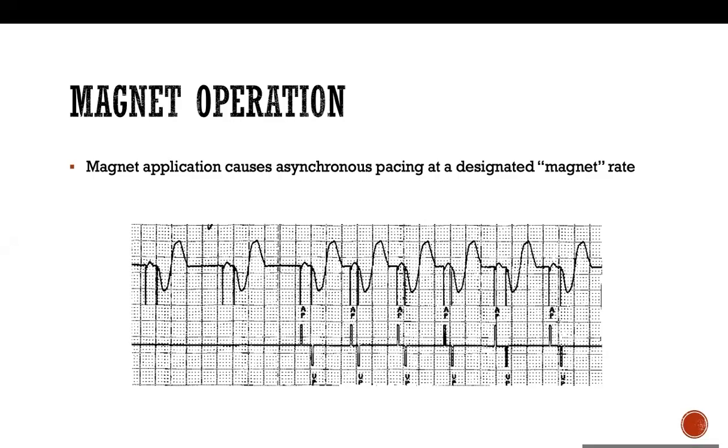So you would change the pacing mode into asynchronous mode. So what is the asynchronous mode that you're going to program the pacer at? VOO. Exactly. So VOO is a single chamber device. DOO is a dual chamber device. But also you could change a dual chamber device into VOO. If you only want to pace the ventricle, you don't need to overdrive pace the atrium.